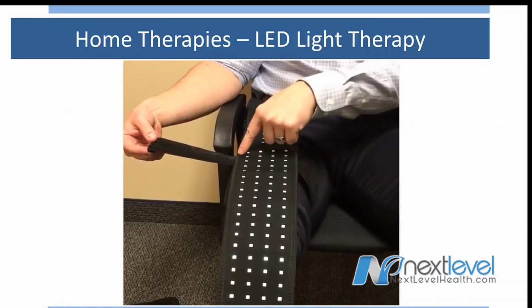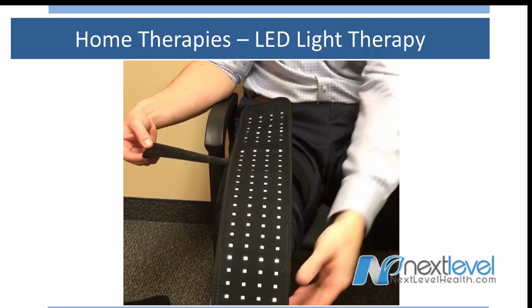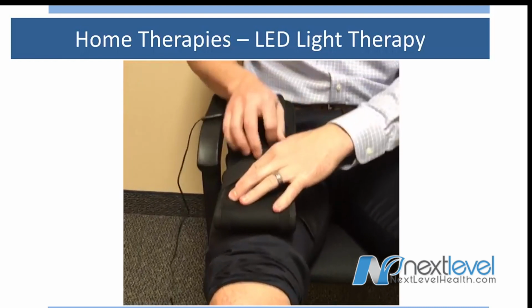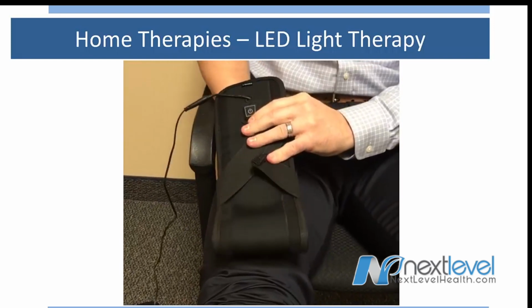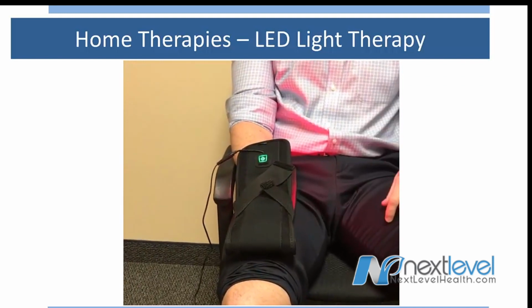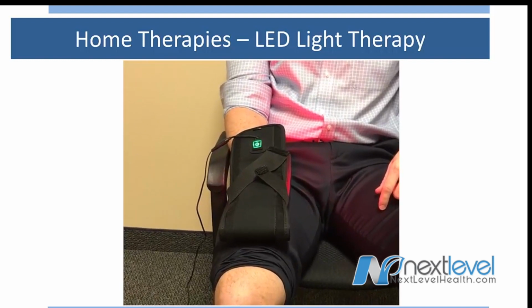To use the lights on your hands, you're going to want to take up one piece of Velcro, put it on the bottom just like with the feet, fold the light unit all the way up so that it's even at the top, bring both pieces of Velcro up, attach to the top to create almost like a glove, put your hands in all the way to the front, press the power button on. Once you are done, remove the lights, put them on your other hand, and repeat the same process.